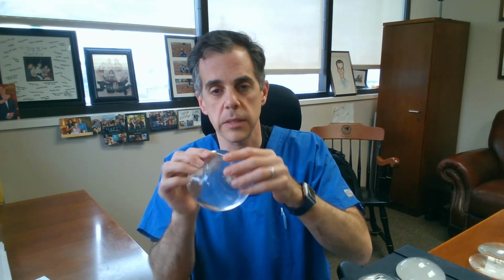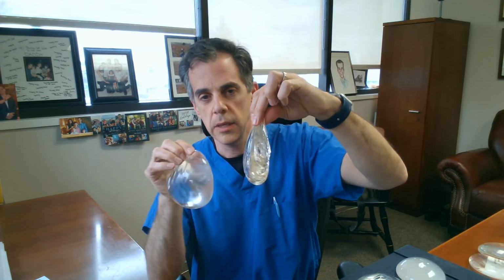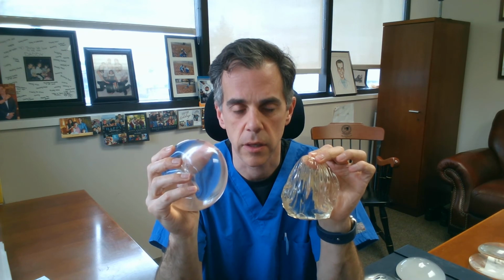When we talk about silicone implants, if you look at the history, back in the 1980s, a lot of silicone implants were used. In 1992, they were taken off the market due to concerns about safety, and then put back on the market in 2006. There's a huge difference between the silicone implants of today versus the implants from the 80s. If you look at a silicone implant today, it's thicker, it holds its shape, it has a little more structure to it. If we compare it to the 1980s silicone implant, it's a much thinner wall. The silicone inside has much less structure, less cohesive. And you can see how this is just not going to last as long as what we have here.